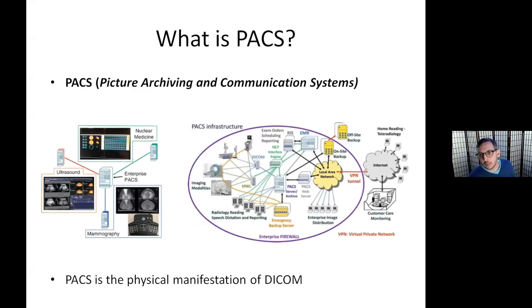So what is PACS? I mentioned this, DICOM and PACS. This is that third key: ontology, DICOM, and PACS. PACS is the picture archiving and communication system, and it's essentially the physical manifestation of DICOM. If DICOM was a soul, PACS is the body.